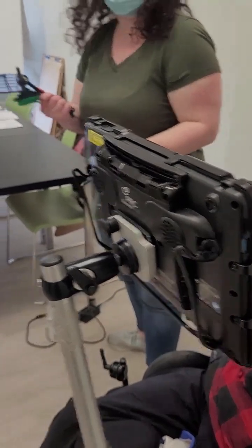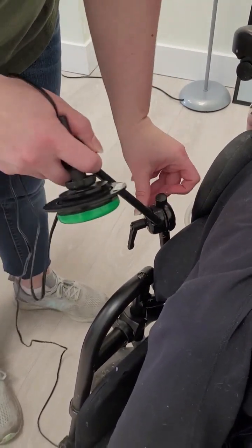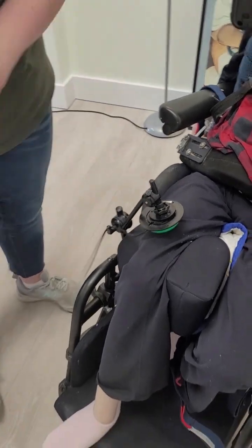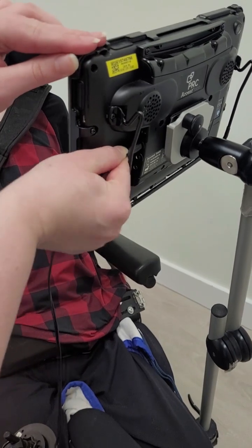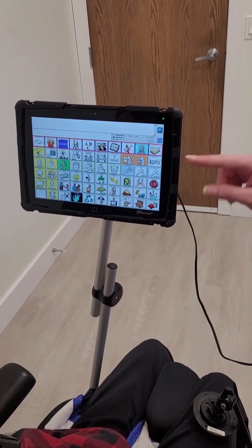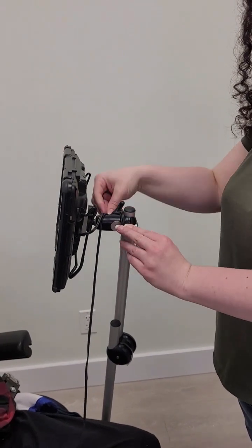Going back to the same second drawer, you'll find her button which connects right here. It's righty-tighty, lefty-loosey — it will tighten in this hole. Slide it in, and I'll usually check how far it is with my hand and ask Julie if this is a good position, then tighten it up. Any one of the two holes will work — they're labeled A and B, and both work. When you plug this in and look at Julie's device, the red selector will start switching up and down. If it doesn't, the switch is not working. With the extra cord, usually just wrap it around here to keep it out of the way.